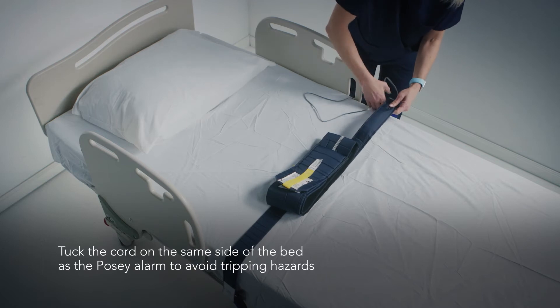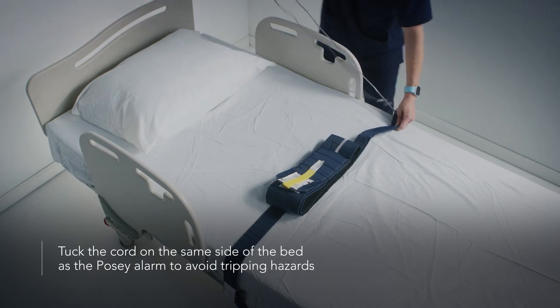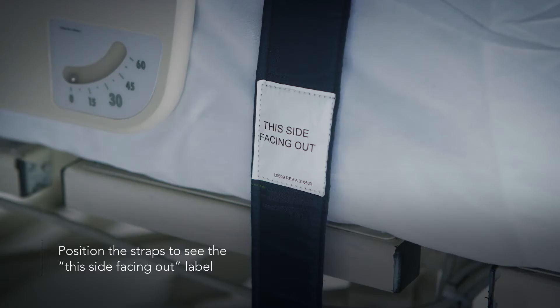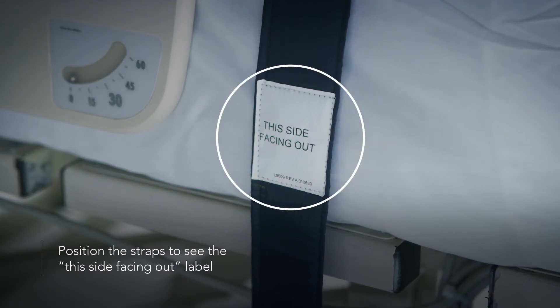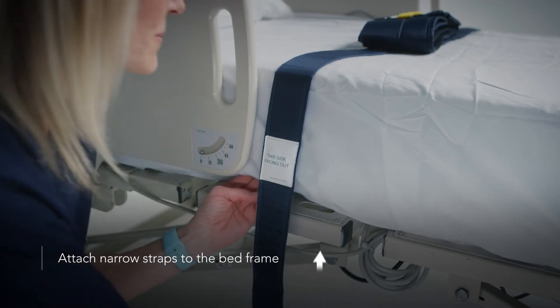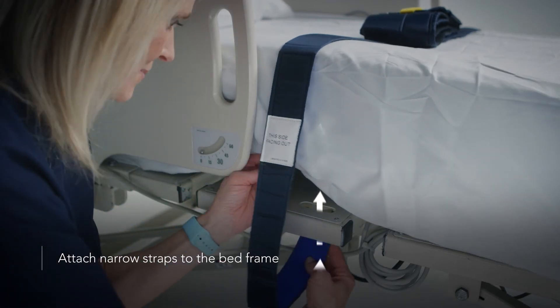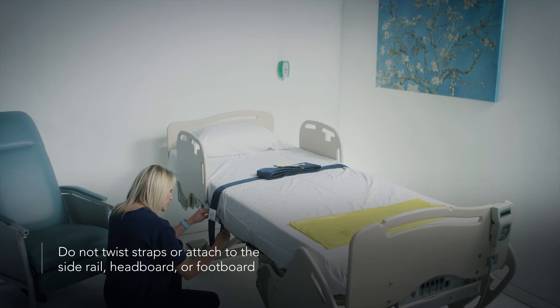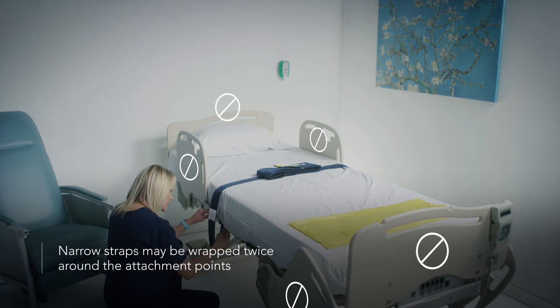Position the belt so the cord is on the same side of the bed as the Posey alarm. Position the straps so you can see the 'this side facing out' label. Attach the narrow straps to the part of the bed frame that moves with the patient. Do not twist the straps and do not attach them to the side rail, headboard, or footboard. The narrow straps may be wrapped twice around the attachment points to decrease the length of the strap.